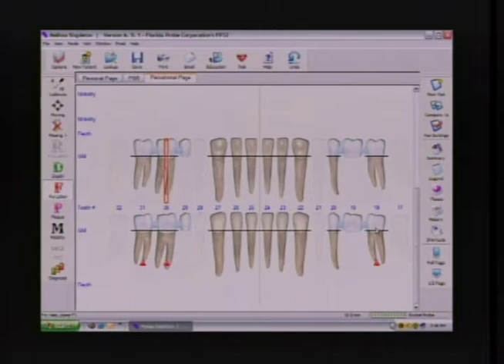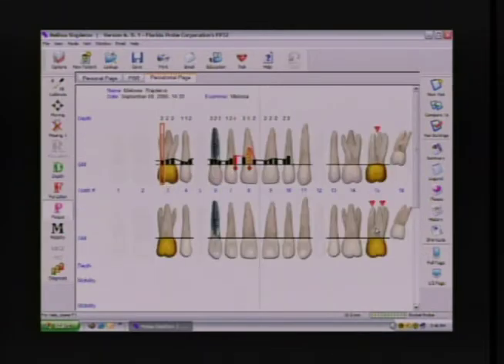Midline. Upper arch. Black. Okay. You jumped through it. We wanted to pause. Now, we were okay with that, and that's fine. It's just a good strategy to pause because I can fix it with the foot pedal. If we wanted to make a change right now, we'd have no choice but to go to the keyboard and mouse. We're in the plaque mode.